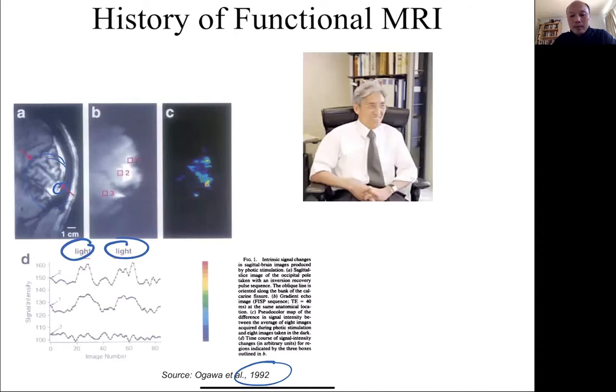is that because the preamps in the MRI changed their gain? The preamps, no, it's more because blood signal can be very small compared to the background. If you get rid of the background, then anything that perturbs the background is causing noise, and so you're reducing that noise factor as well.